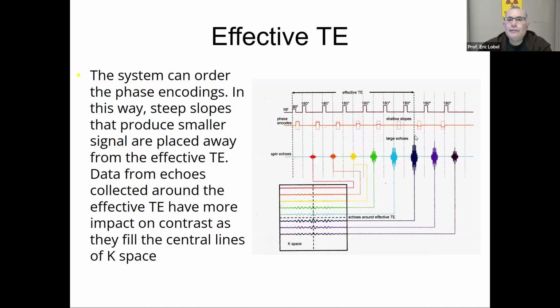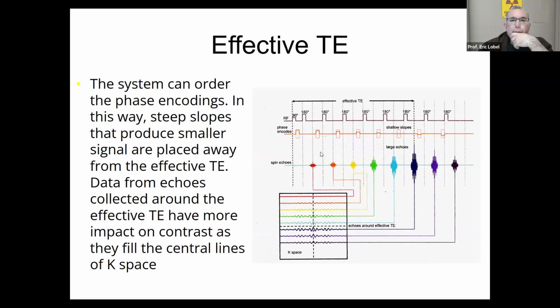And this looks like it's kind of traditional because this large signal is getting put right in the middle, yet the small one is going towards the top. There's also something interesting going on. I want to make this image bigger.